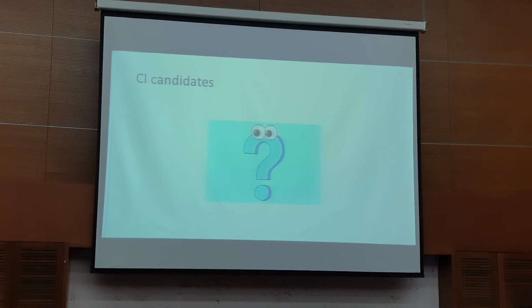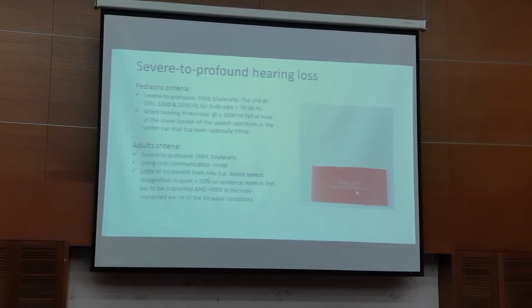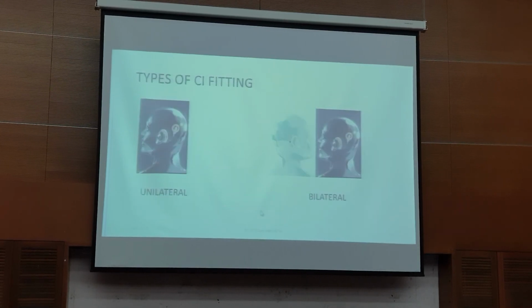Candidates, who do you think are candidates? Because time is short, I'll go through them. Severe to profound losses, definitely. Bilaterally, ski slope hearing loss, and this is in general the audiological criteria. Ski slope hearing loss, and as I said, single-sided deafness. This is in general.